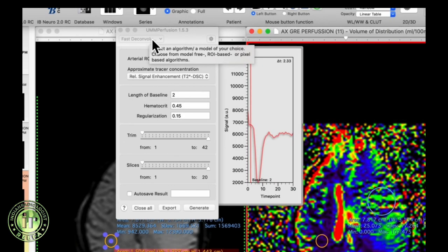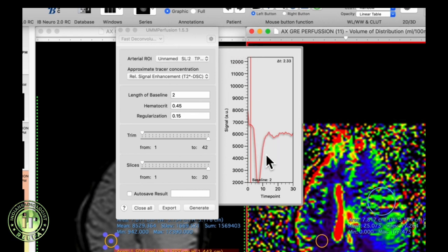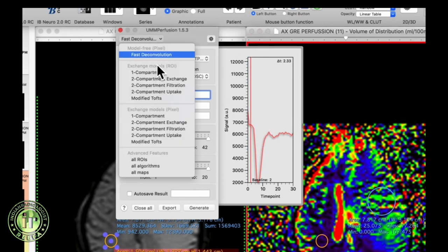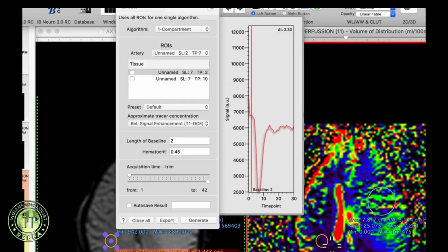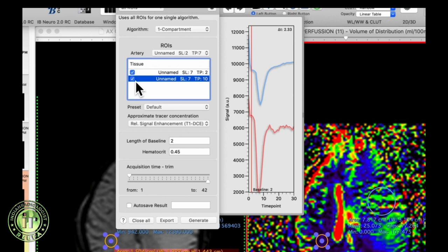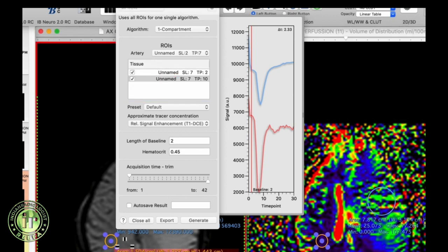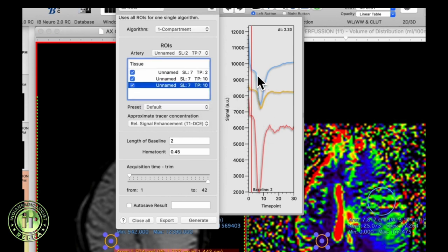To look at signal intensity-time curves for the drawn ROIs, go to All ROIs, select the newly drawn ROIs, check the boxes, and that will display the selected ROI signal intensity versus time curves. The curve in blue is the signal intensity-time curve from the tumor, the curve in yellow is from the contralateral normal appearing white matter, and the red curve is the arterial input function.